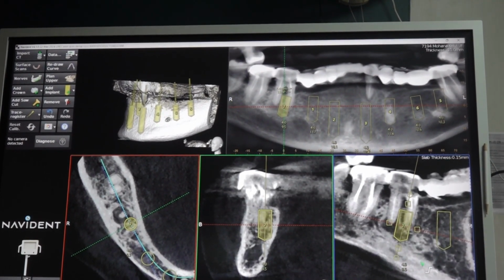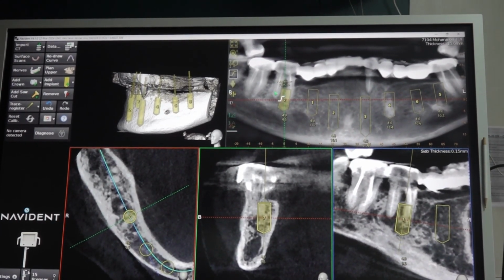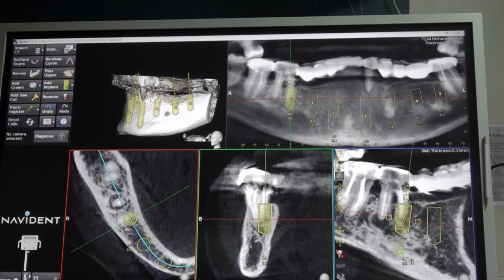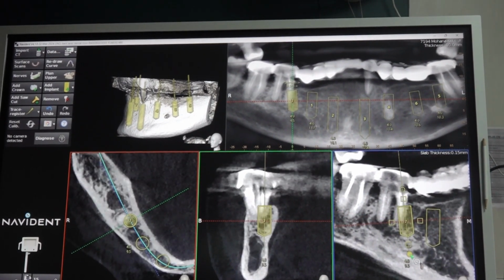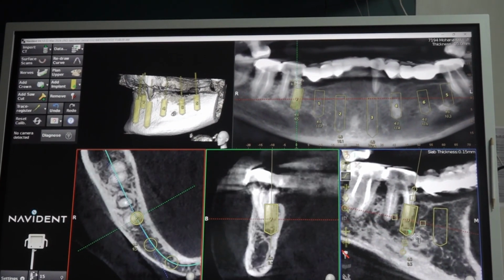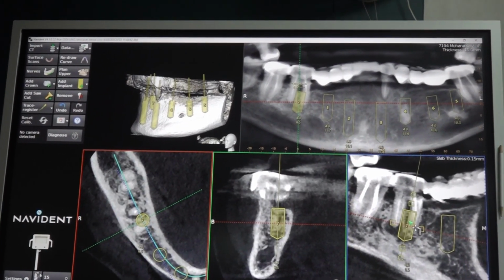And we can place the interdental bone. Or one more technique is just try tilting it slightly, easier. Not much. Okay. Either place a short wide implant in the mesial root or in the interdental area.